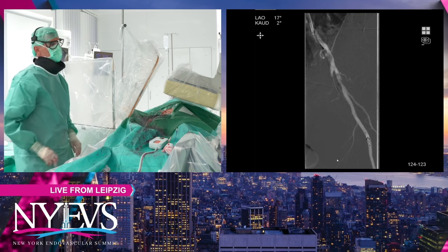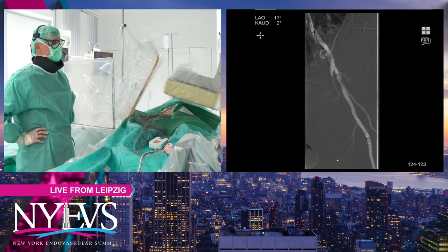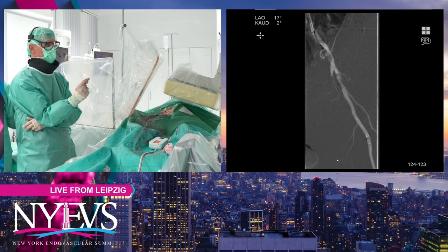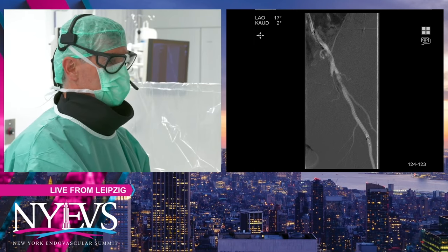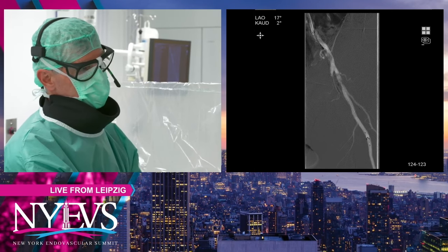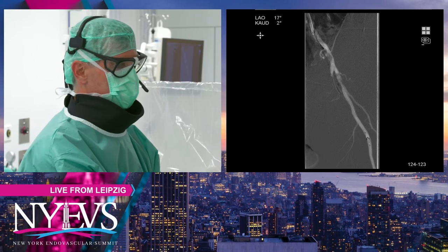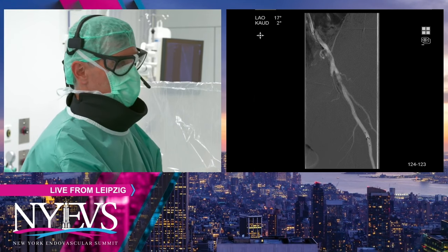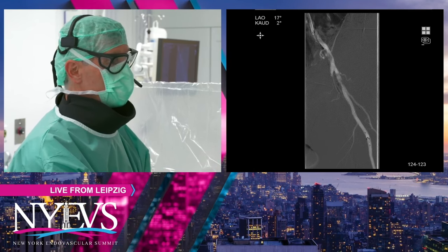Yeah, so Jetstream, because if it's really densely calcified, and here I thought it's really very densely calcified, I in fact prefer the Jetstream if I have the impression that I can go through somehow intraluminally. If it's more an eccentric plaque, then maybe rather a directional atherectomy. And here it's difficult to decide. The profunda stenosis is more what I think I pass through intraluminally, so it's clearly Jetstream for me. It's nice here, but proximal, in fact, it's eccentric. I would say HawkOne could also be an option if it's not too calcified.